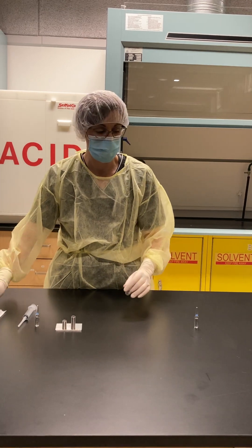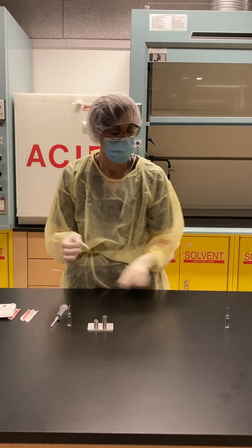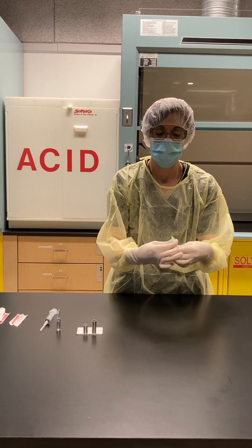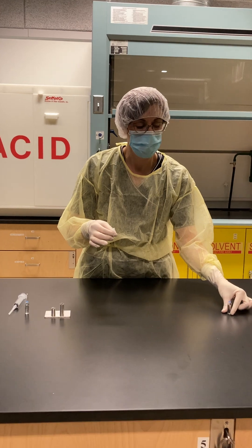Next I'm going to swab my ampoule neck and let it dry.